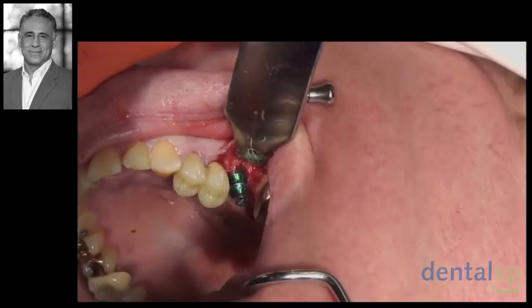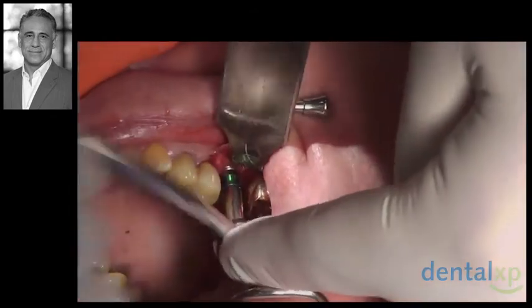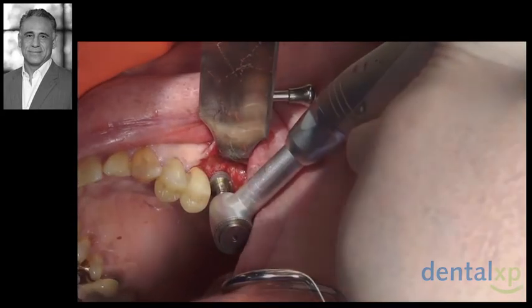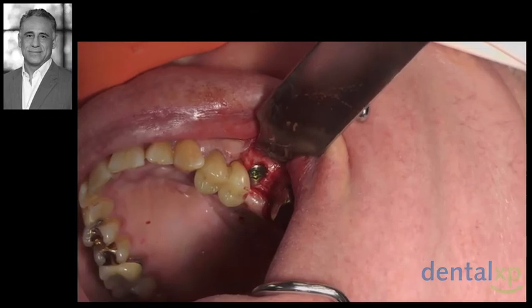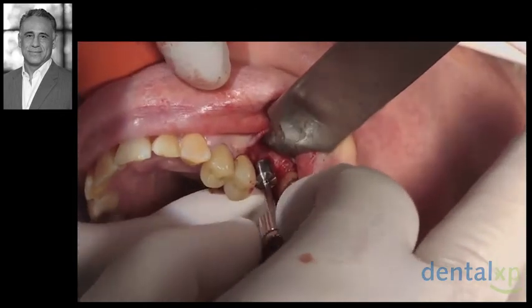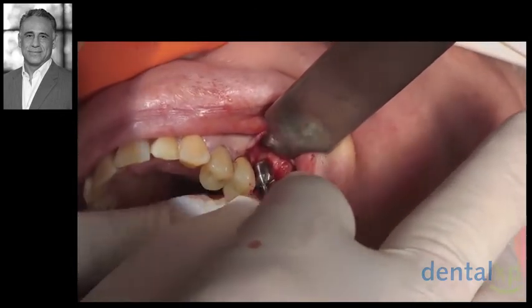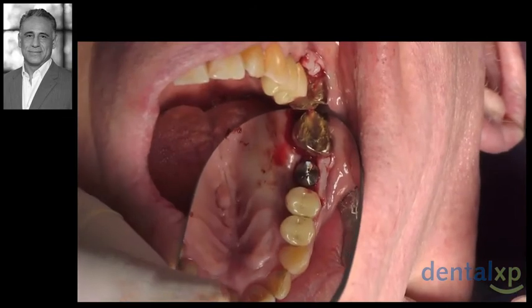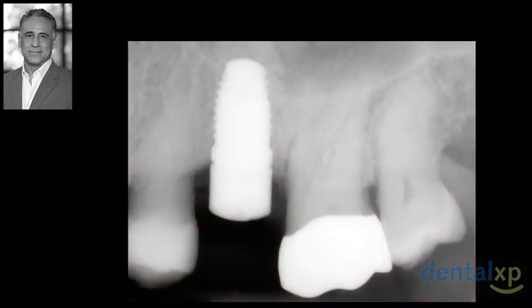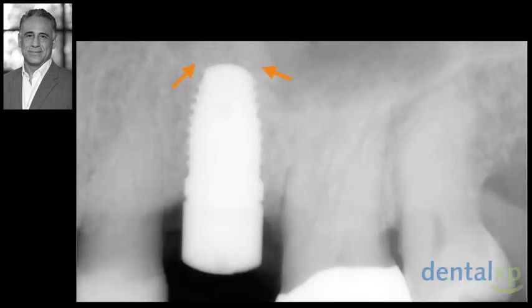The bone tap is rotated until it's fully seated and then backed out. We can then proceed with the placement of the implant until it is seated fully. The healing abutment is also placed, knowing that we have great primary stability with no concerns about occlusal loading on the healing abutment during its healing phase. Here is our final implant in place and development of the apical bone beyond the implant apex. We'll allow the implant to heal for about 3 to 4 months before its final restoration.